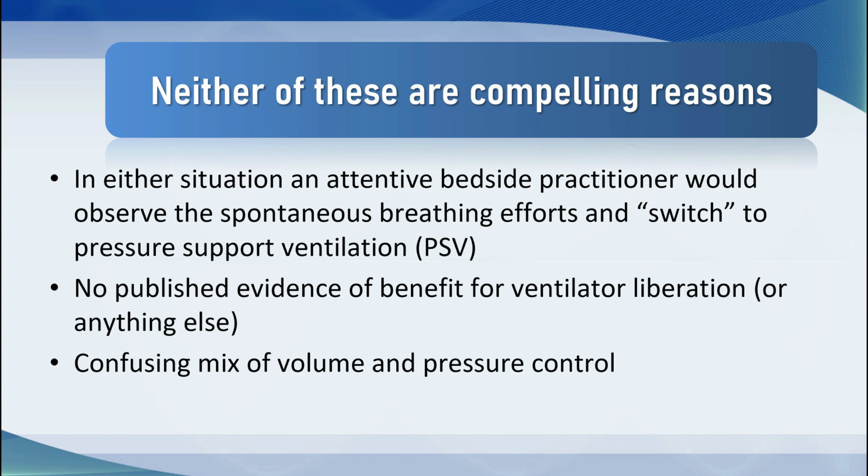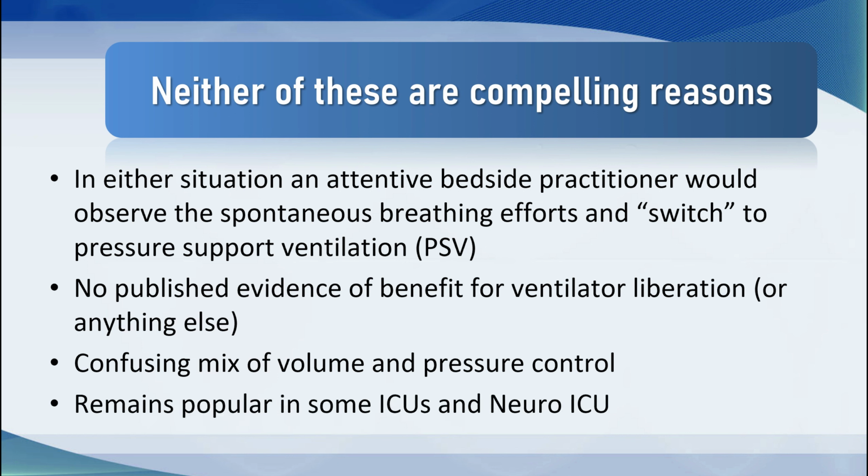And there is this whole question of it being a mixed mode of ventilation where you're mixing volume and you're mixing pressure. So I don't know, it has a role maybe, but only in very limited settings. It does remain popular in some neuro ICUs and some other ICUs where anesthesiologists are the main practitioners in the unit. And I wouldn't criticize doctors for using this mode. I do think it's a suboptimal approach to be using in somebody, for example, who has hypoxic respiratory failure.